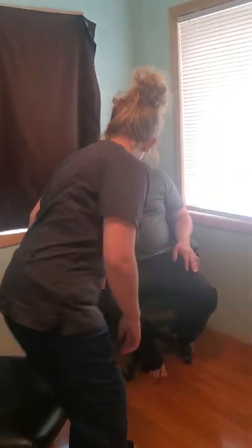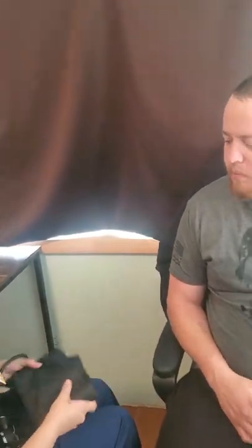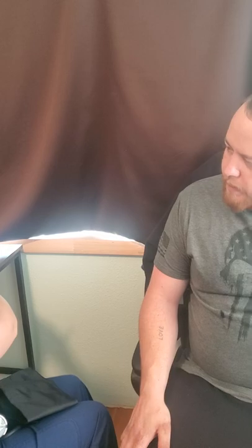Could you say your full name and your birthday, please? Robert James Cooper, 9/23/90. Thank you. What is your normal blood pressure reading? About 150.